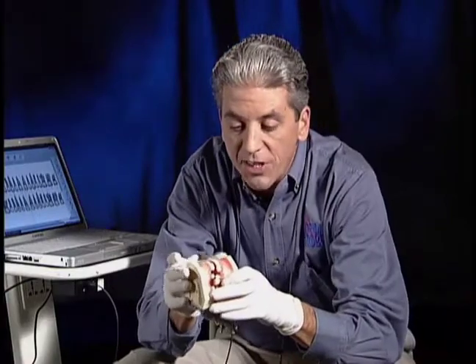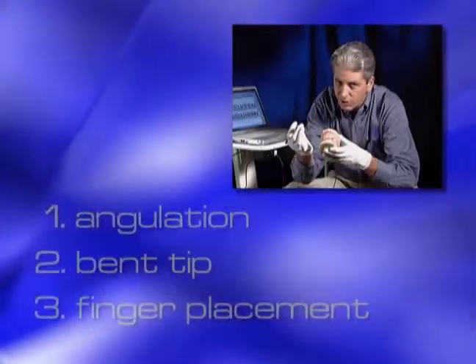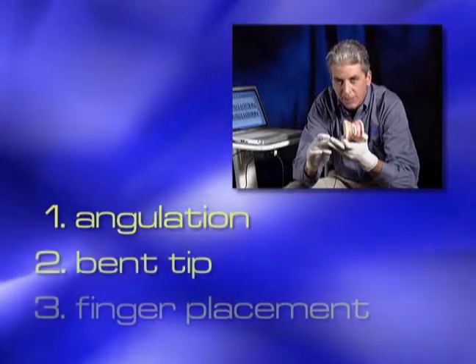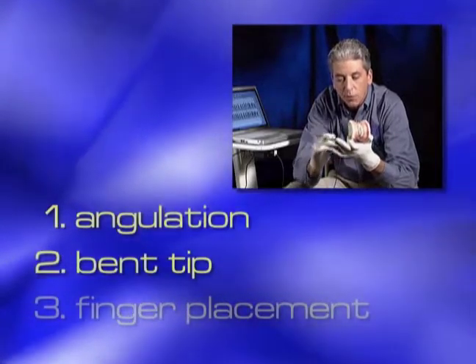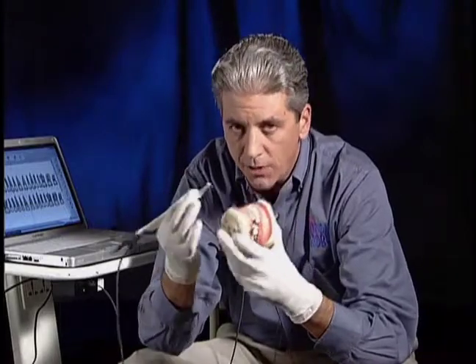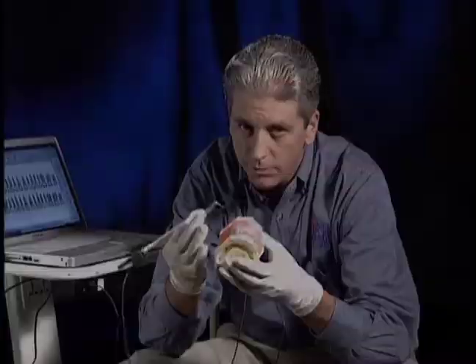The Florida probe is absolutely less invasive than traditional probing if done correctly. There are three very simple issues: angulation, bent or kinked tip, or finger placement. If you are getting patient reaction, think of those three things first.